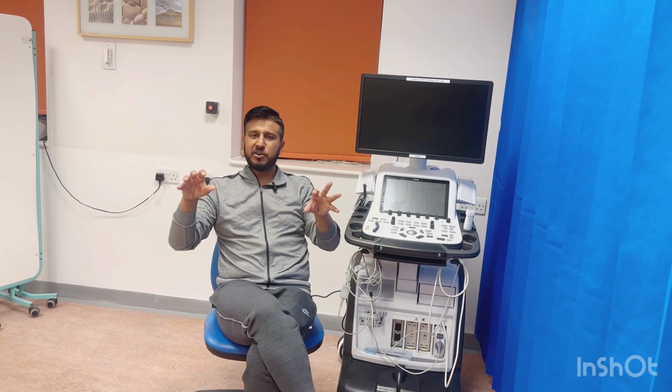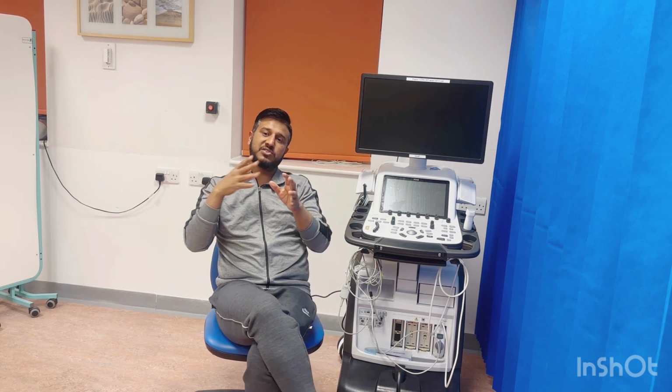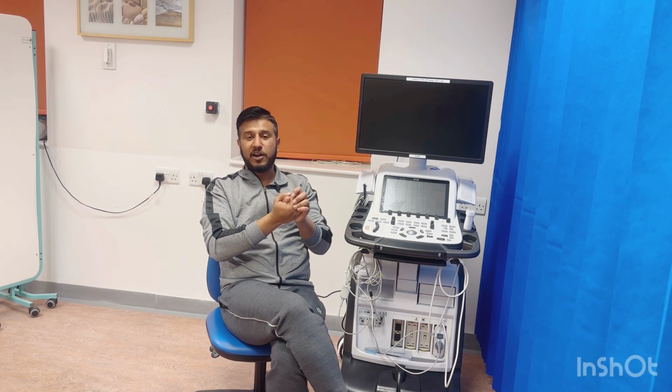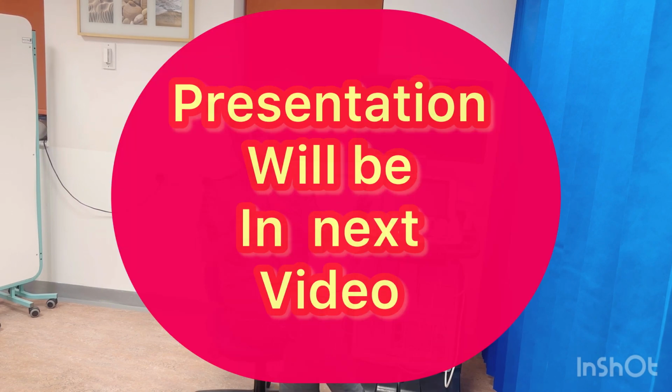And now I will show you a presentation. It will be just an overview, the same thing as I told you already. And I will tell you the numbers as well, like how much the vena contracta should be for mild, moderate, severe, and how much the other parameters would be. Okay. So let's come on to the presentation on the computer and I'll show you there.